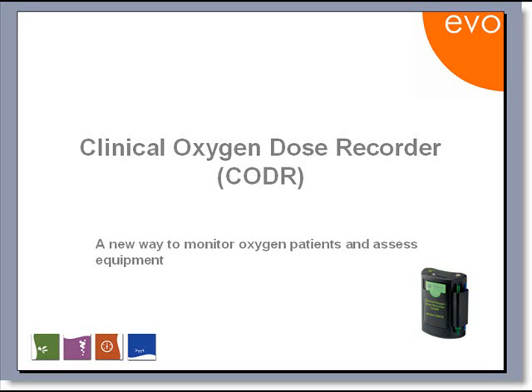Well, that's it for the CODR overview. It's a revolutionary new way to monitor a patient and document outcomes.